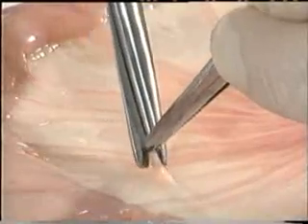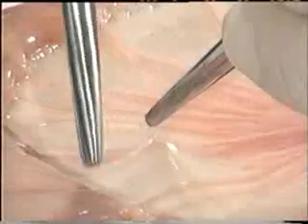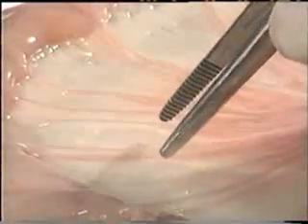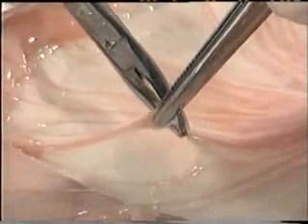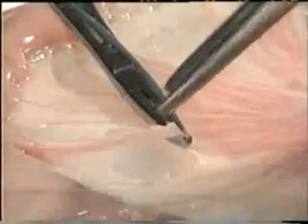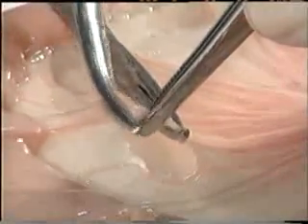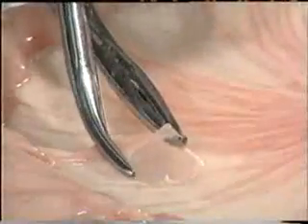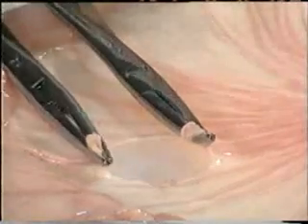In this situation, the peritoneum is divided through both leaves of the small bowel mesentery, either side of the leash of vessels. The entire pedicle is then picked up and placed in the hemostat, which is laid down gently, and a second hemostat is placed as demonstrated here. The pedicle can then be divided with scissors and a suture placed round each of the hemostats and tied, again using a reef knot.